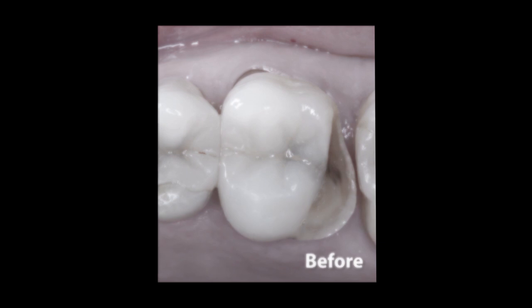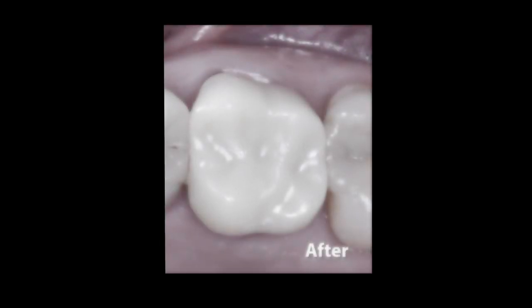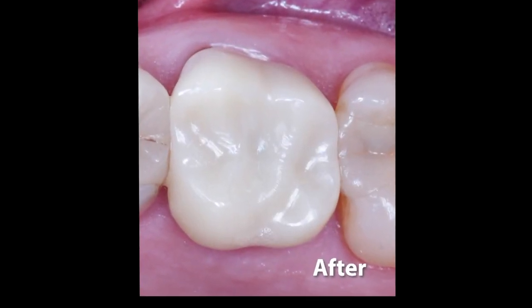And there you have it — zero compromise for an immediate Bruxer crown using the Glidewell in-office solution.